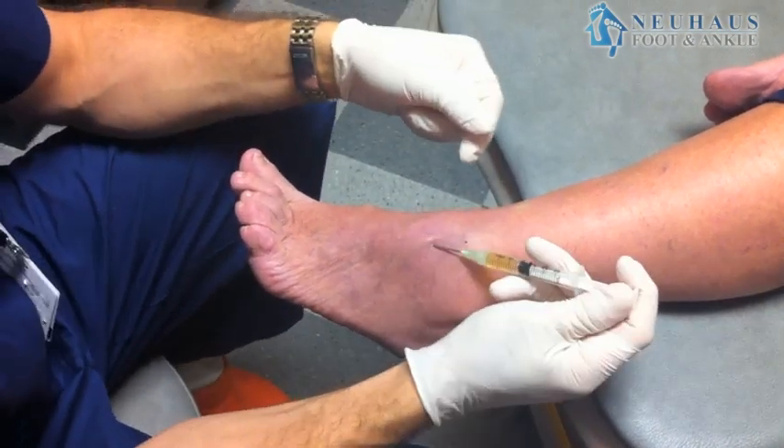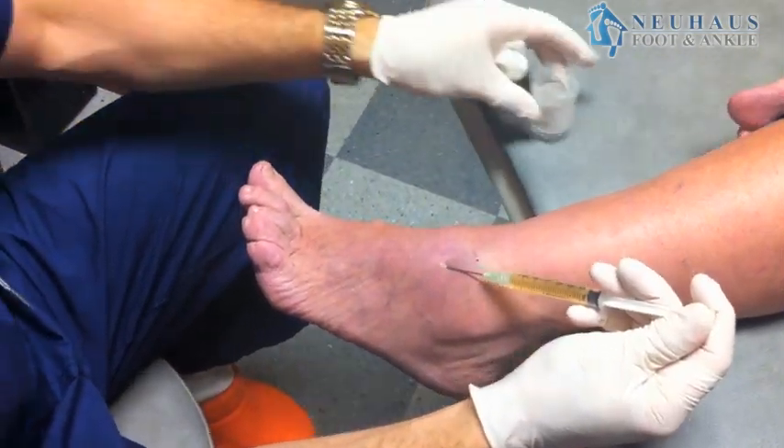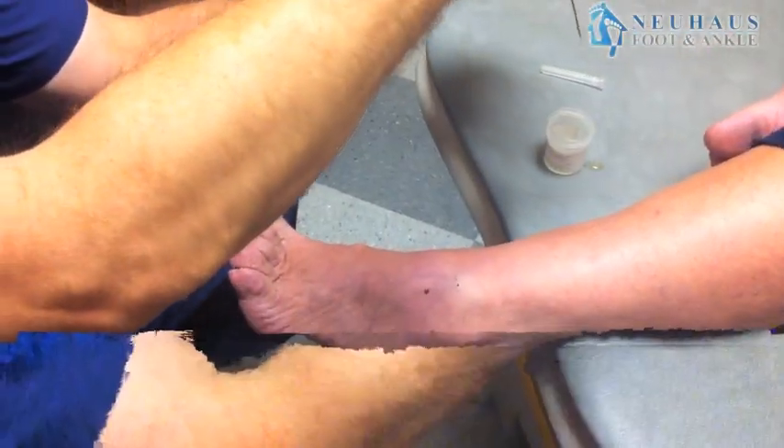A ganglion cyst is a fluid-filled mass. Here you can see I've already numbed this patient up and we're draining fluid straight from it. You can see it's a clear, yellowish — it's actually a very thick fluid.